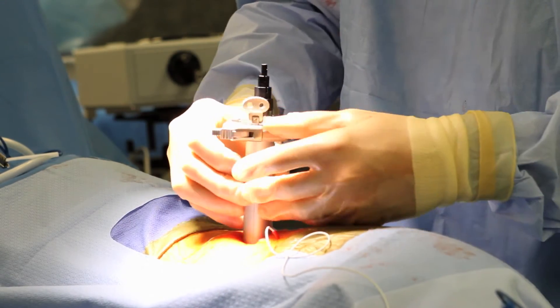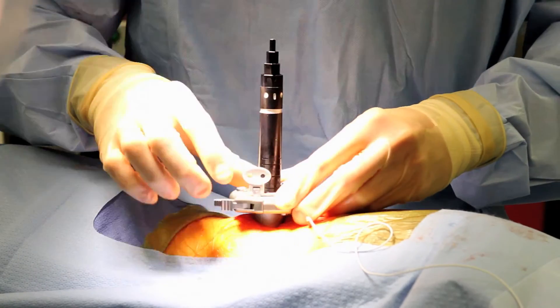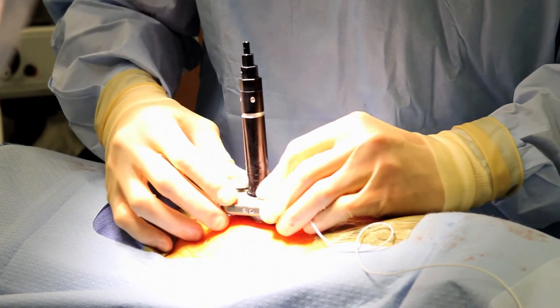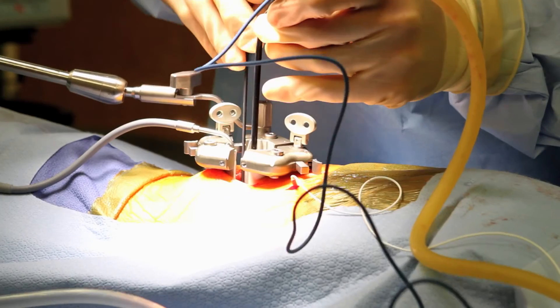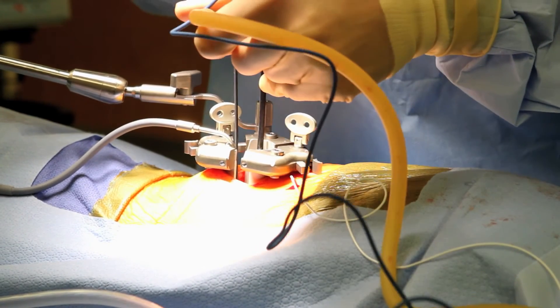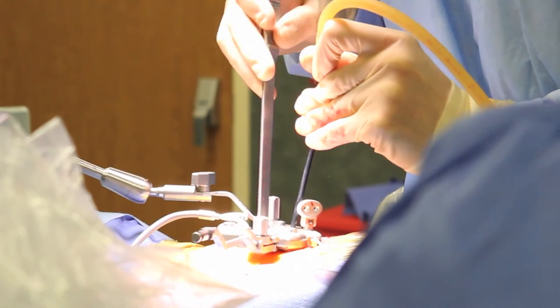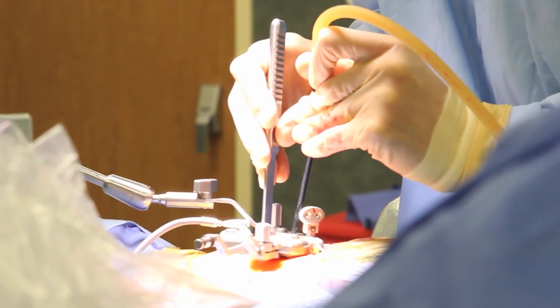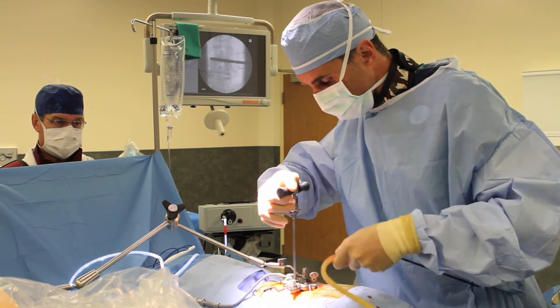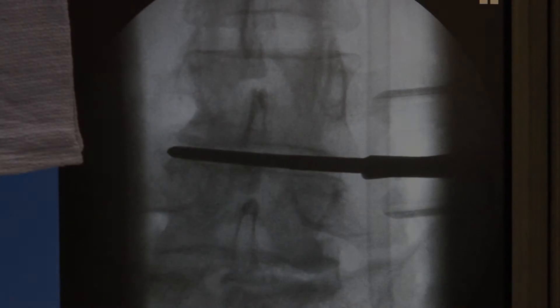Surgery is performed through the lateral access retractor, which is placed over the dilators. This specialized retractor provides safe minimally invasive exposure of the affected disc space. An intraoperative EMG probe is used to identify a safe entry zone to the disc space. The disc space is opened and then prepared for minimally invasive lateral fusion with specialized surgical instruments. The entire procedure is performed safely under intraoperative fluoroscopy.